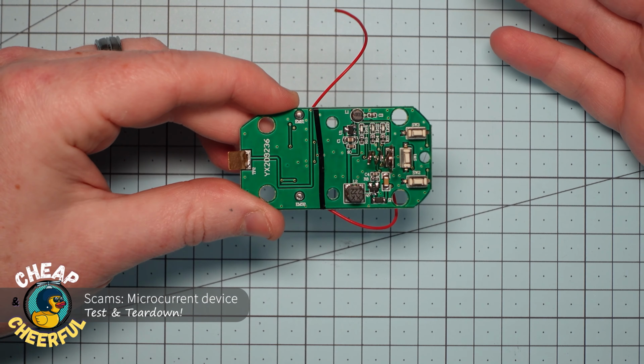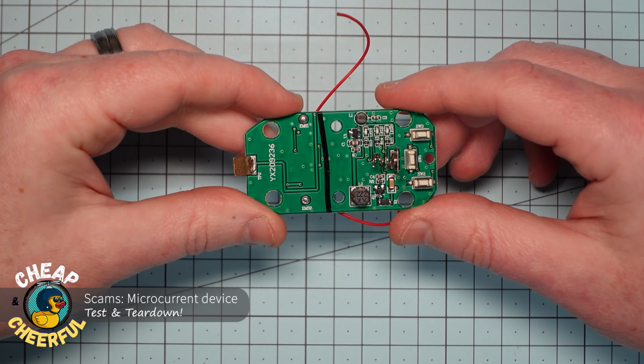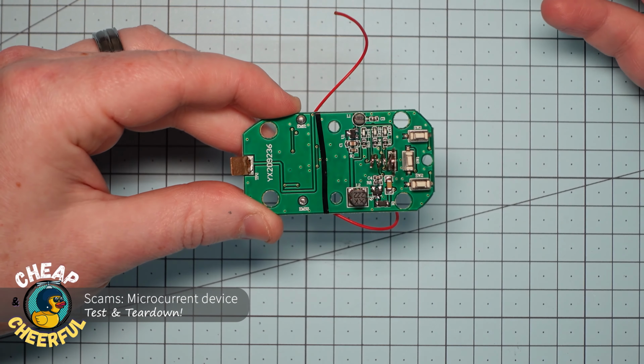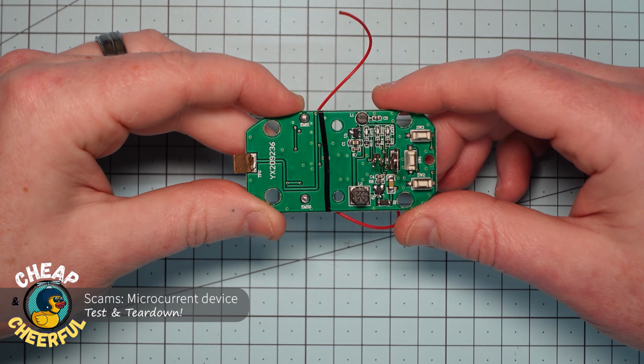And yeah, that's all I've got for you guys today. I hope you enjoyed this look at the microcurrent device from Wish/AliExpress. Certainly a scam, but an interesting one nonetheless.